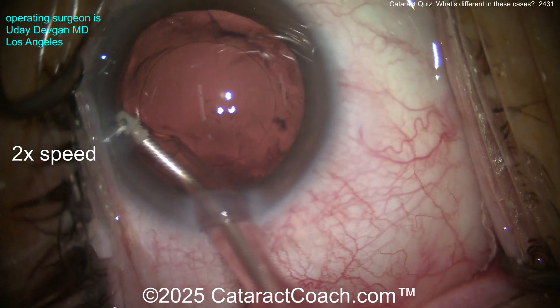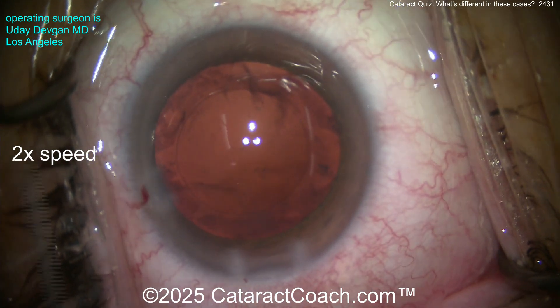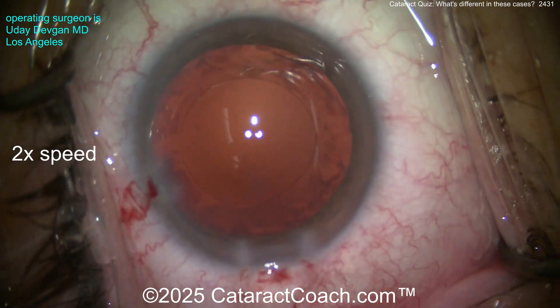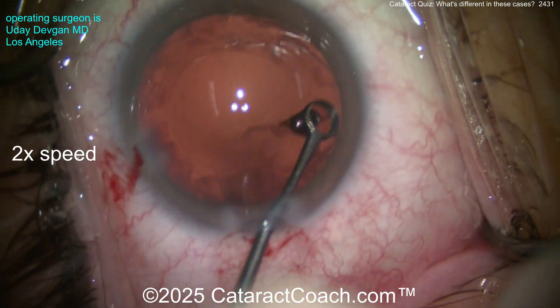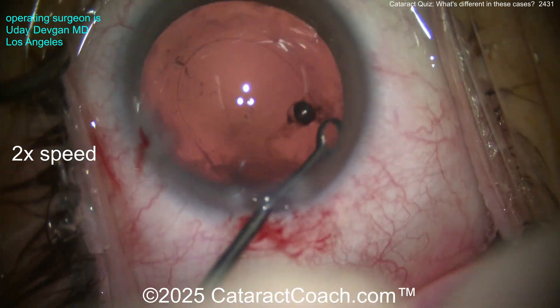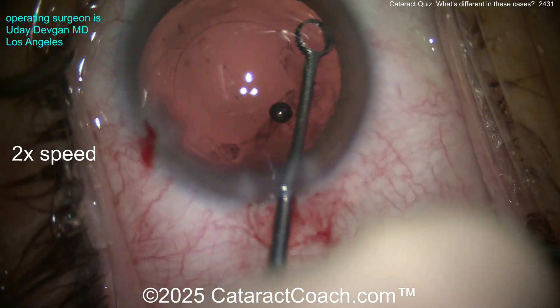What do you want to do now? Let's finish up the case. First, get some viscoelastic — probably could have put viscoelastic in before coming out of the eye, but it'll still be fine. We know we have perhaps a small quadrant of iatrogenic zonular loss, and that's okay. It's a very small quadrant — should be of no consequence.